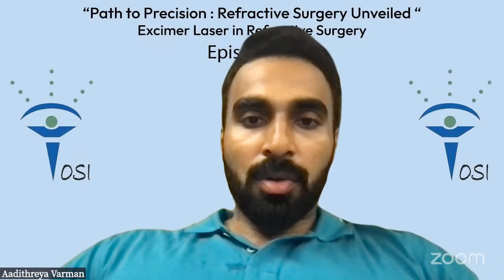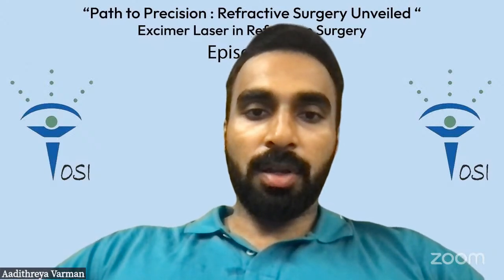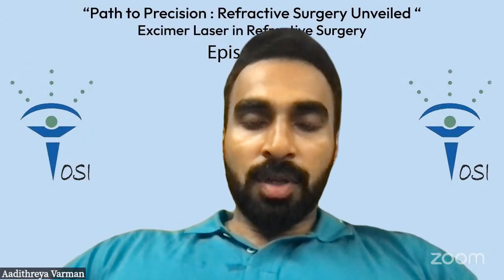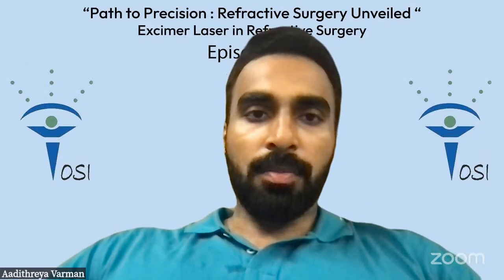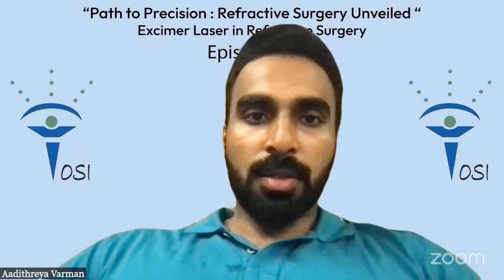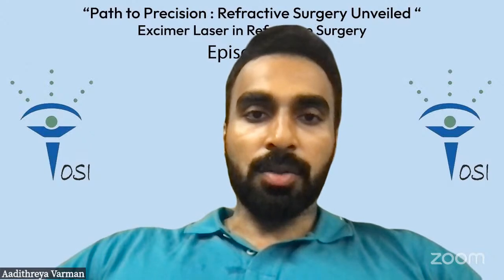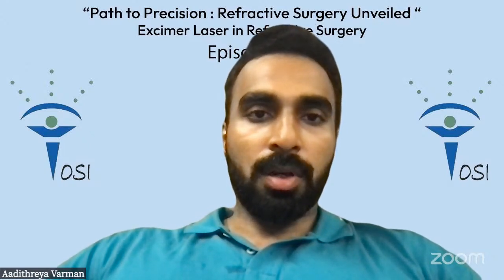And also, thank you for mentioning the impact of fluence checks before every session, because that is very important. Temperature, humidity, everything can impact the fluence and the energy output. So I do fluence checks before every patient actually. That really helps, so you'll have lesser incidences of overcorrection or undercorrection.